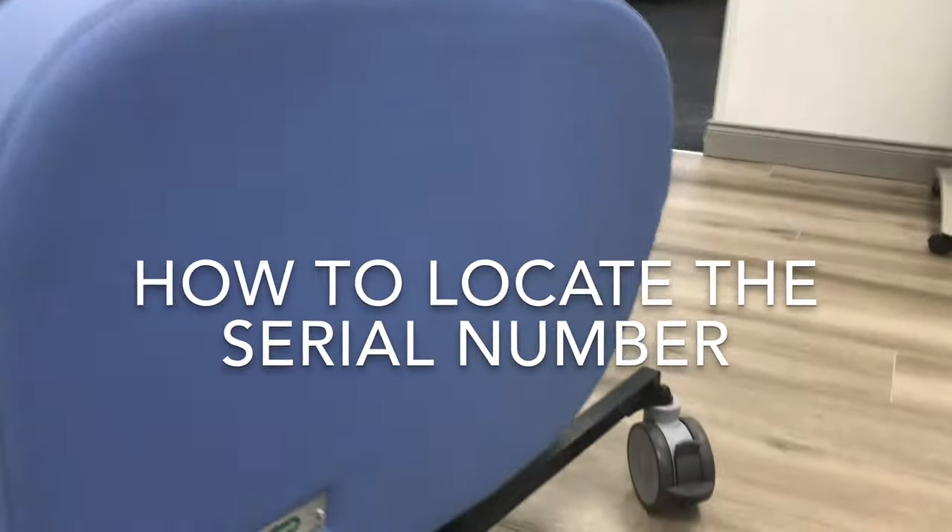In this short video I'm going to show you how to locate the serial number on the Seating Matters chairs. On the Phoenix, Torrento, and Bariatric chair, the serial number is located at the bottom of the back of the chair.